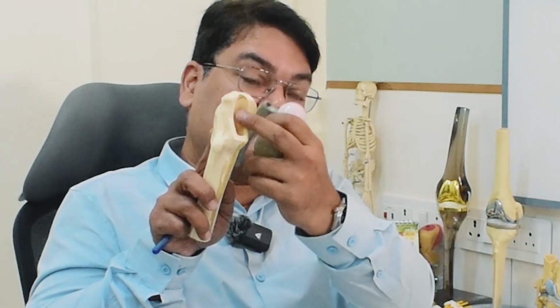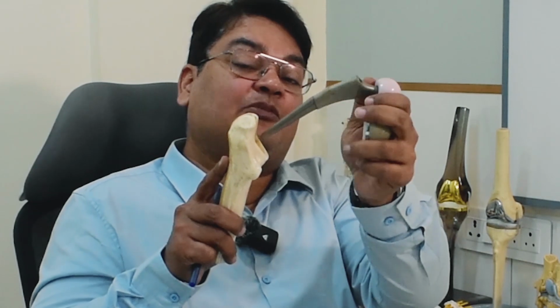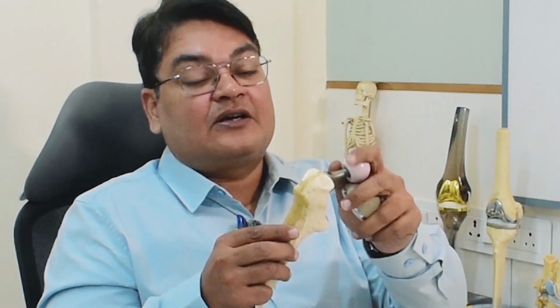The choice of stem, cemented or uncemented, is decided on the table. Several times the canal in which this goes is very thin, very narrow, and we cannot put uncemented. In that case we may have to put cemented. Several times the bone is very soft. In that case also we may have to put cemented. So it is decided on the table. And as far as the cup is concerned, it's mostly uncemented. We try to make it uncemented as far as possible, but of course cemented can be put.